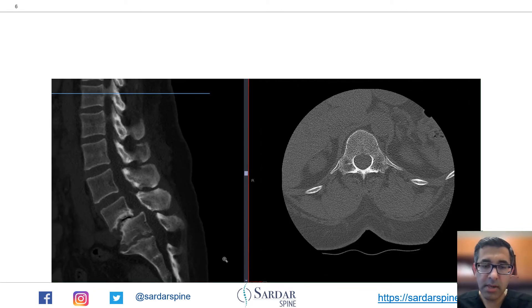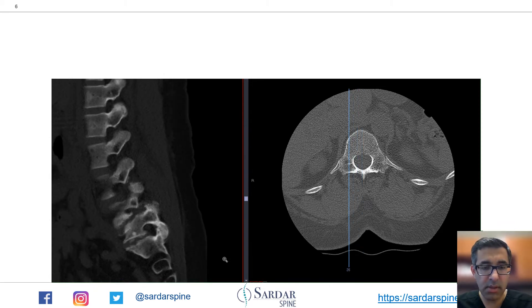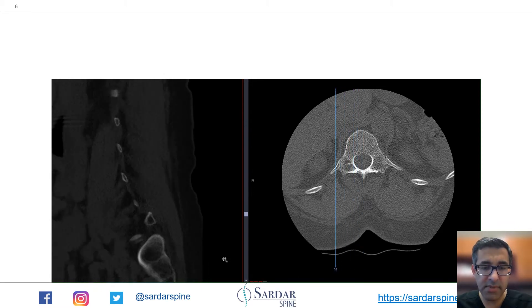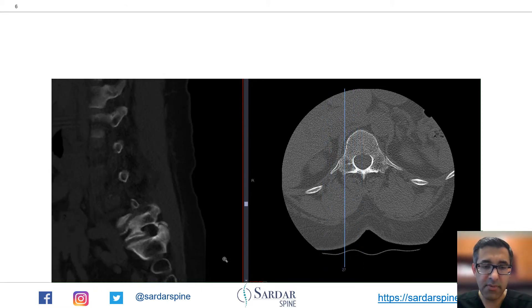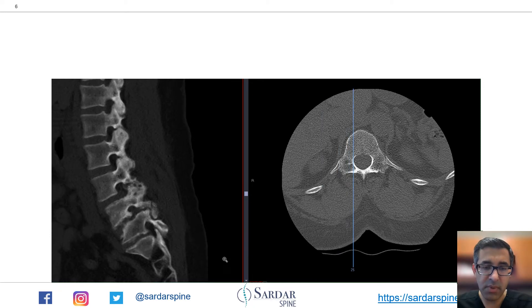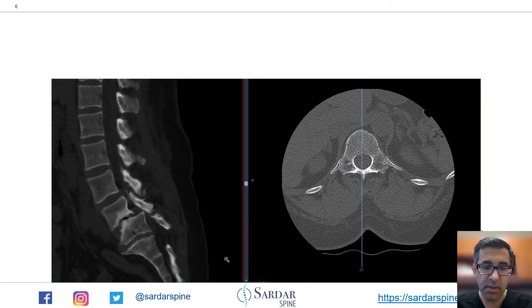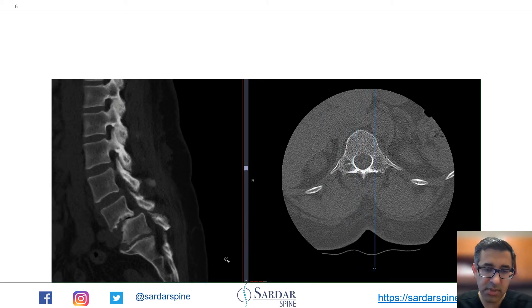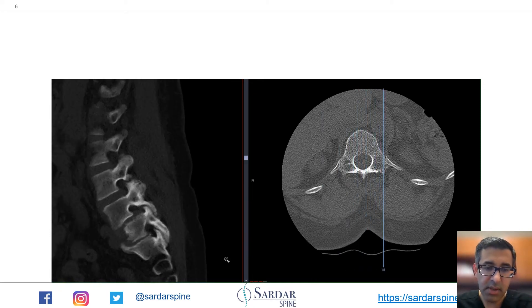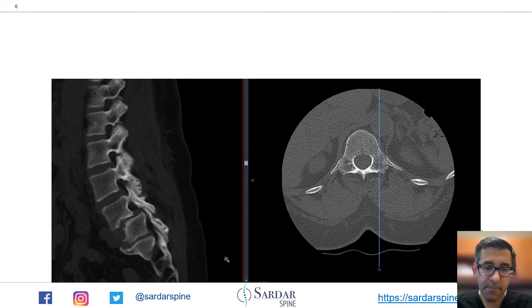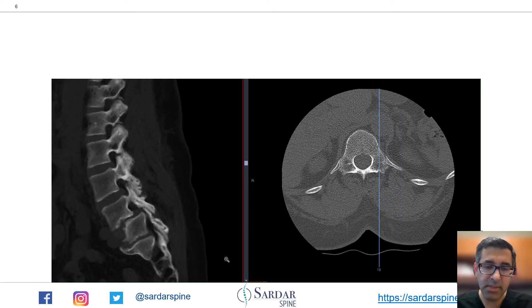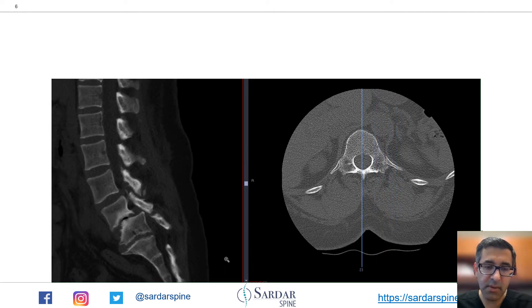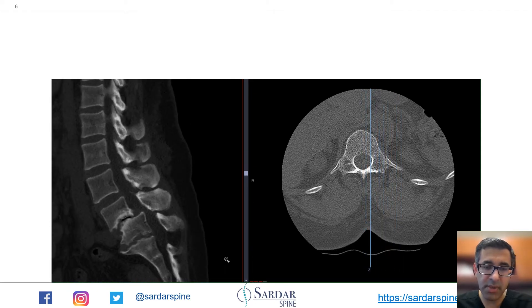Here's a CT scan of the same patient's spine. You can see that the facets at L4-L5 and L5-S1 are quite eroded. Even at L3-L4 it's really eroded, and there is collapse and degeneration from L4 to S1.